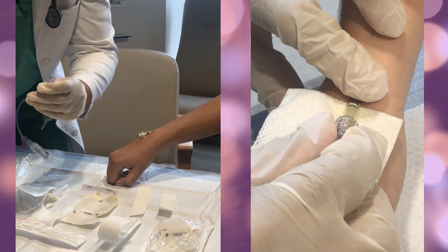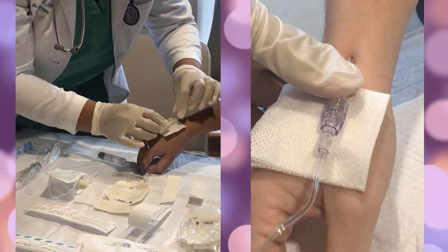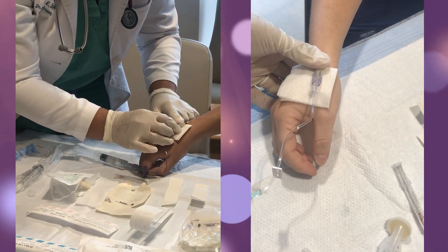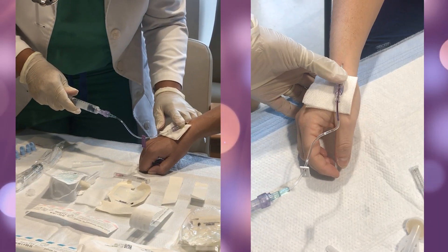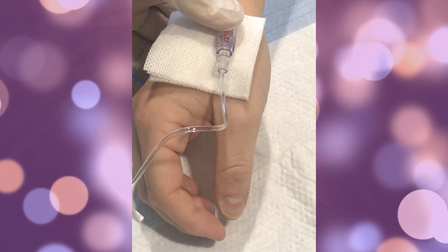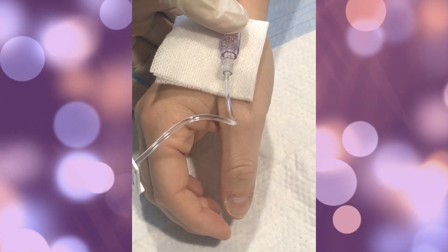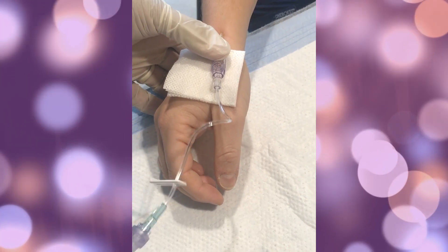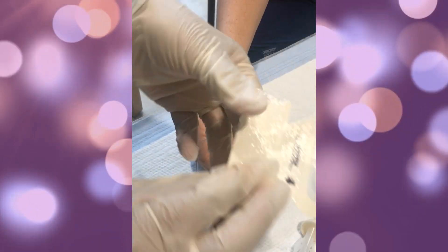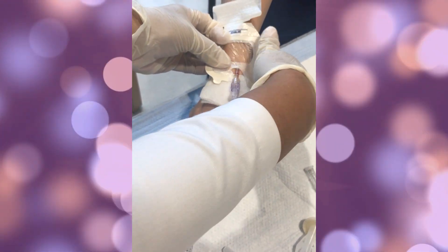Remove the tourniquet that was applied prior to insertion. To check the patency of the IV site, place a 2x2 gauze from the IV start kit underneath and press down to prevent blood from flowing out. Attach the flush of 10cc normal saline to the IV extension and pull back slightly — blood in the tubing confirms the catheter is in the vein. Then flush the IV site with about 8cc of 0.9% normal saline. I use only 8cc so there are no bubbles in the tubing, while still having enough to clear the IV tubing.